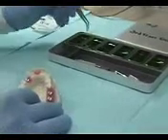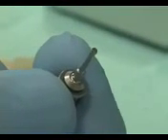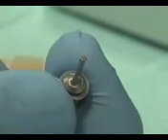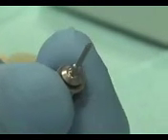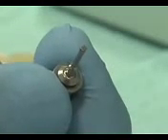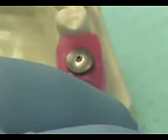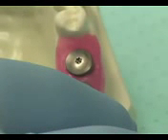So if we take our patient and I pick out a screwdriver, and you can see it may show up reasonably well, the end of this looks a little bit like a star shape or a Torx wrench. Now that shape is also the recess in the top of our healing screws, and so this wrench fits very securely into the little healing screw.